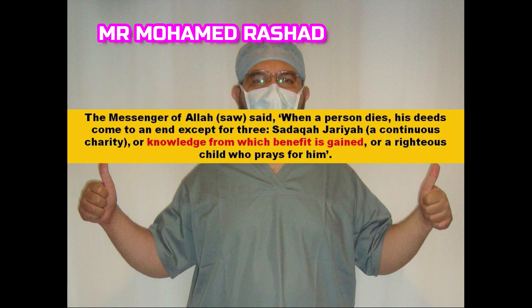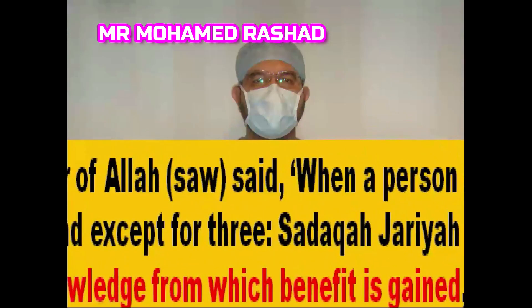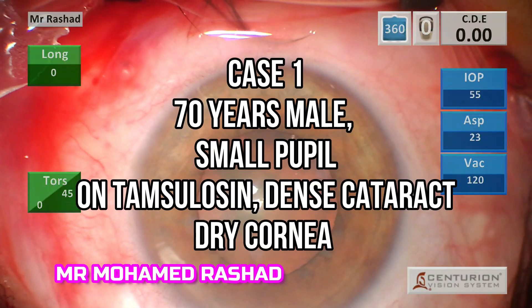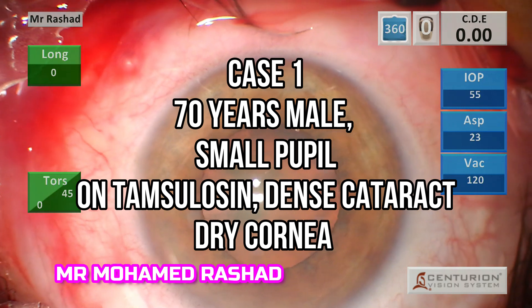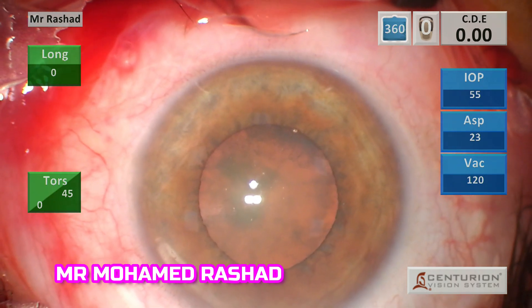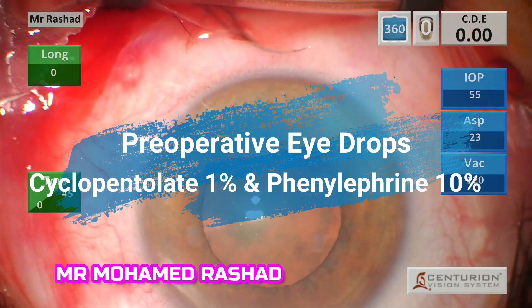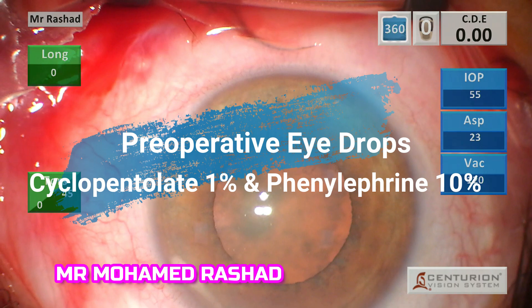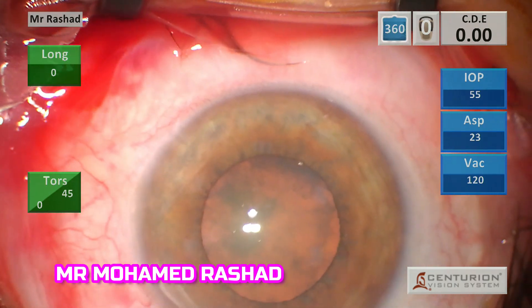This is the first case: a small pupil with dense cataract on tamsulosin and floppy iris. We usually use cyclopentolate 1% and phenylephrine 10% to help with pupil dilation.